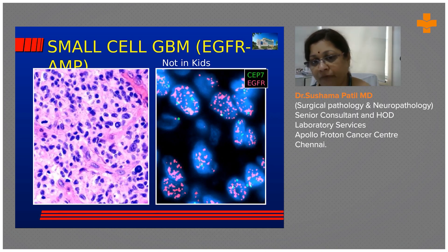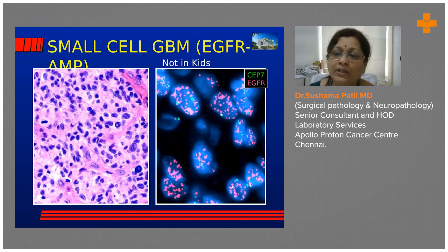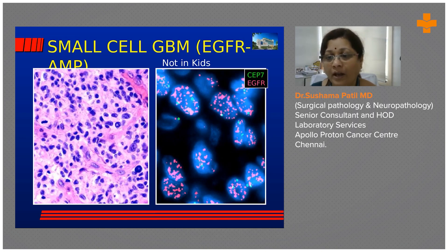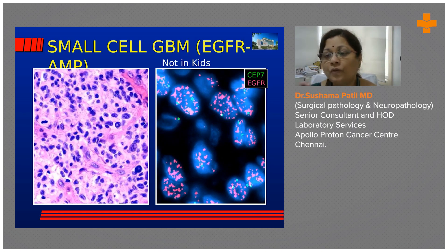Anaplastic oligodendrogliomas should have 1p19q codeletion — I'll come to that later. But remember that in small cell glioblastoma, about 80% show EGFR amplification. All the red you are seeing in every cell against a blue background represents amplified EGFR signal. When we do FISH, we always carry a reference probe — CEP, which stands for centromere enumerating probe.